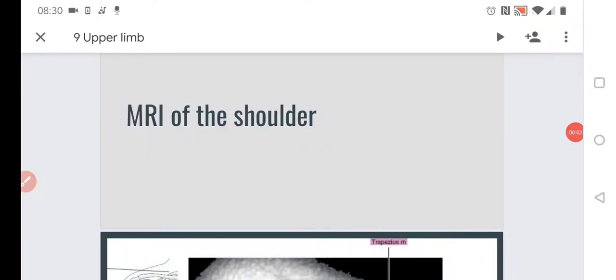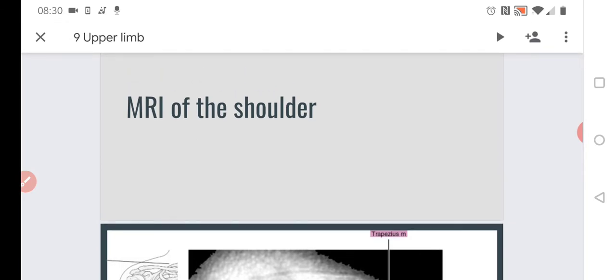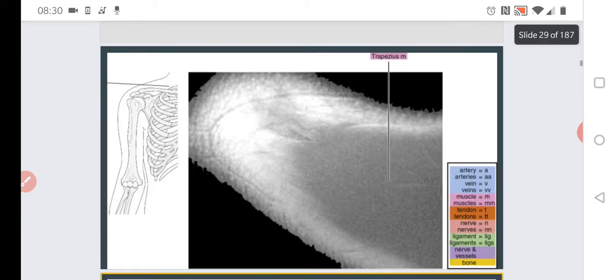MRI of the shoulder. Shoulder is very complex, of course. And why are we using the MRI now? We had some general overview using the CT scan. However, CT scan is not the best study to do in case of the joints. It would show bones well, even better than the MRI, but all other structures are hard to visualize.